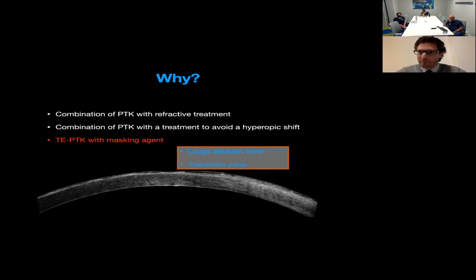Okay. So then, Esteban, if you were to come across a 30-year-old patient who has recovered from a contact lens related scar, infectious keratitis, and you do the OCT and you realize the cornea is entirely normal, except for where the scar is, there's maybe an epithelial plug of about, I don't know, say 100 microns. So you have this small, say 1-2 millimeter area of epithelial plug, but everything else is normal, and they say, no, I don't want to wear contacts anymore because of what happened. I want to get, say, laser vision correction. So for the patient with this otherwise normal cornea, except this 100 micron plug of epi that shows a dip where the scar was, how would you go about doing laser vision correction?